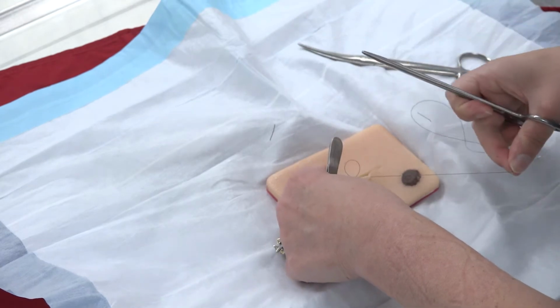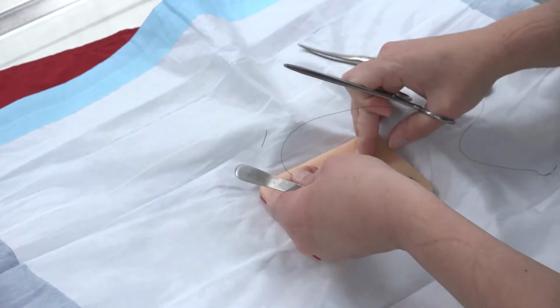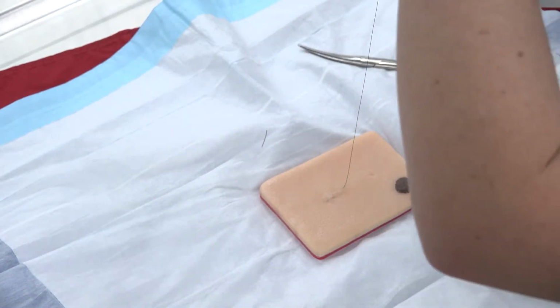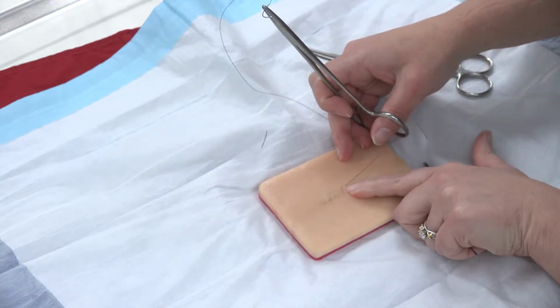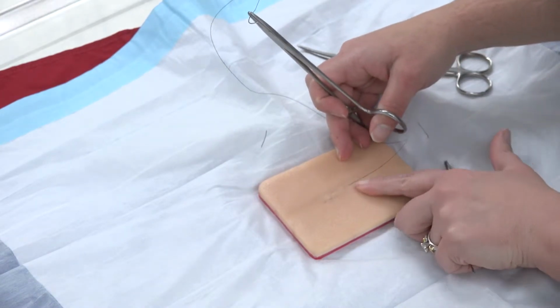And you can see that if it's down there, it's going to want to squinch this up. Oh, it tore right through. But what will happen if you do that is when you pull it, this side will then squinch up like that. Now, is that a disaster? No. You can take it out.